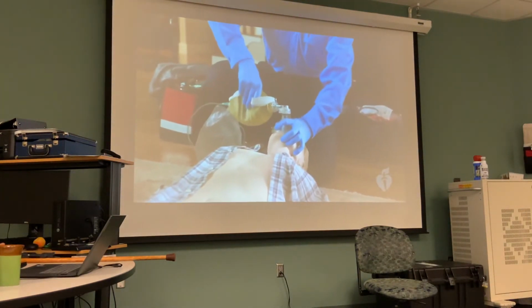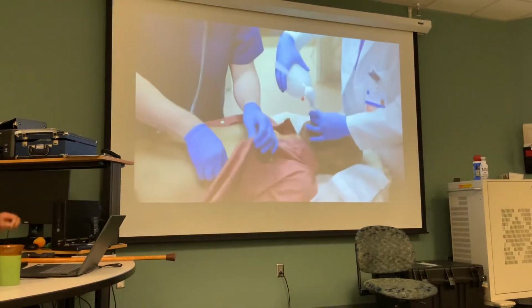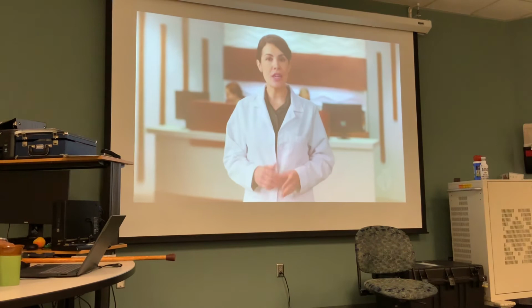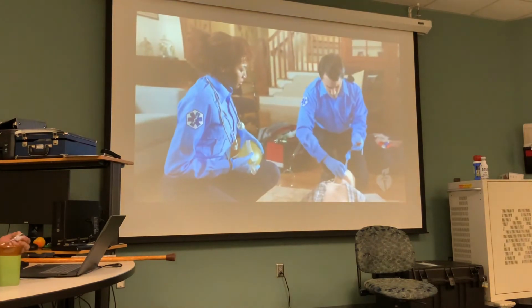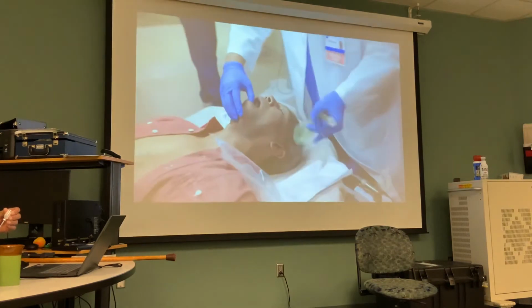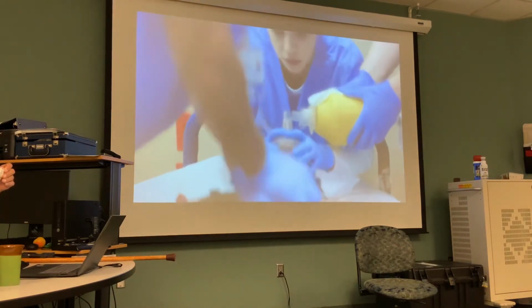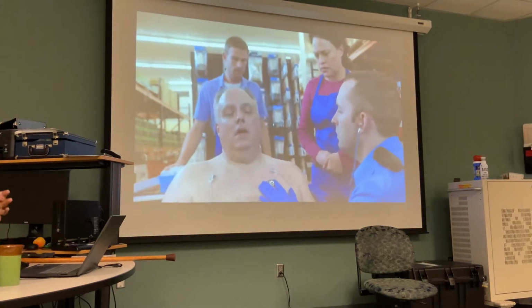Airway management is a life-saving skill, one that both basic and advanced healthcare providers should be able to perform well. It is one of the key interventions for BLS and ACLS. It is critical before, during, and after cardiac arrest. The optimal method of managing the airway will vary based on provider experience, training, scope of practice, EMS or healthcare system protocols, and the patient's condition.